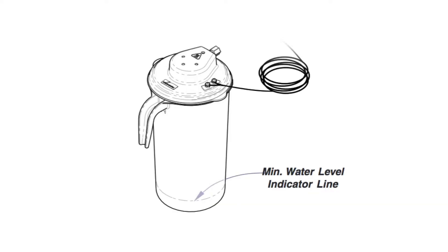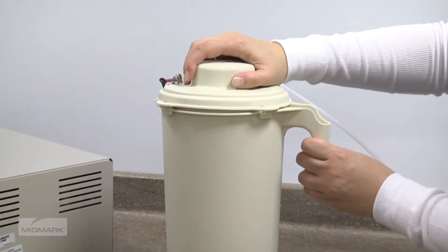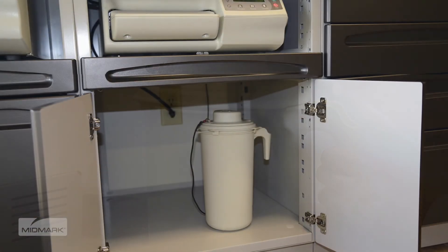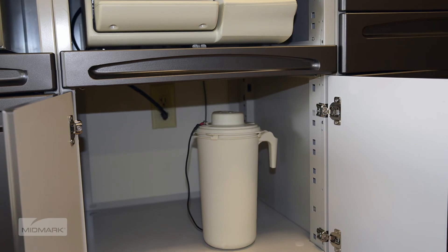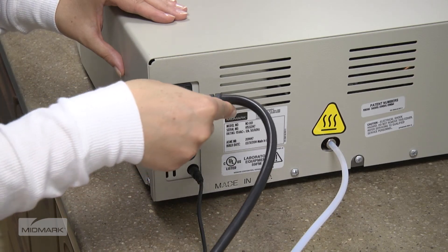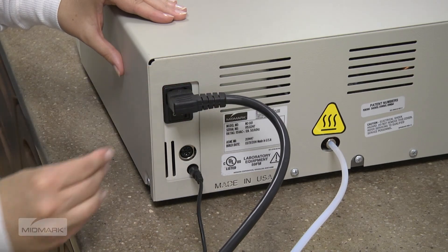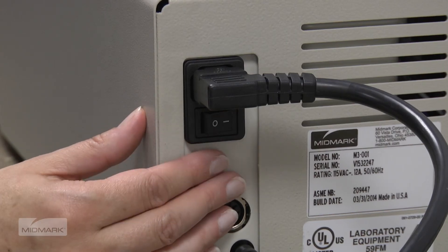Fill the tank with tap water to the minimum water level indicator line. Insert the lid assembly into the pitcher, align the tabs for correct positioning, and rotate clockwise to secure. Place the tank on a level surface, no higher than the sterilized support surface. After ensuring proper electrical requirements, attach the electrical cord to the back of the autoclave, and then into the wall socket. Turn the unit power switch to ON.